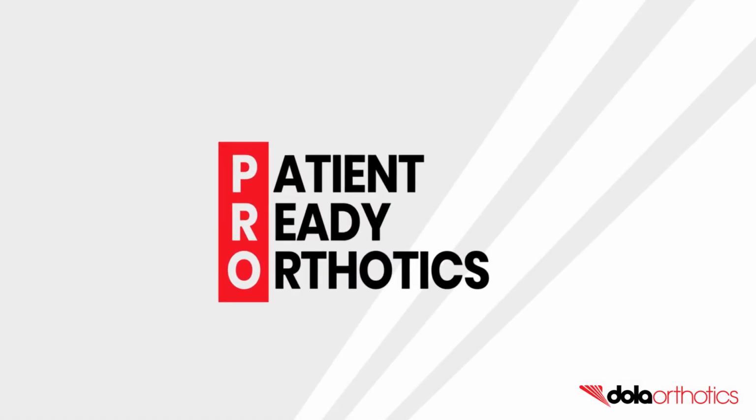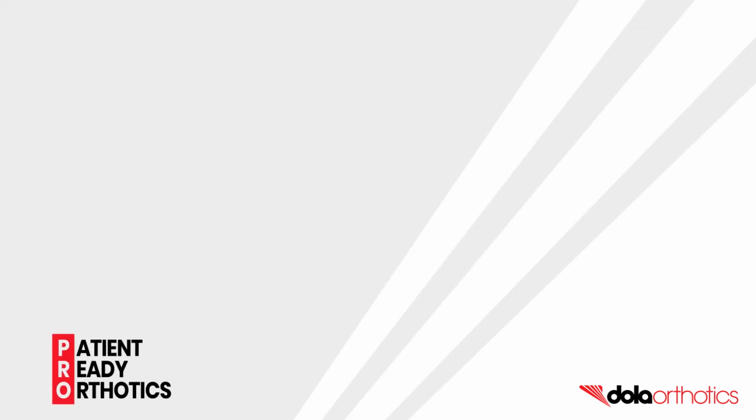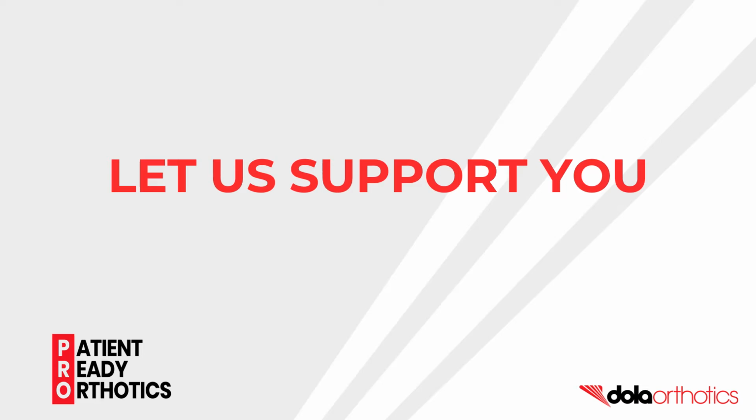DOLA patient-ready orthotics. The orthotics podiatrists use. Build orthotic confidence with our support.